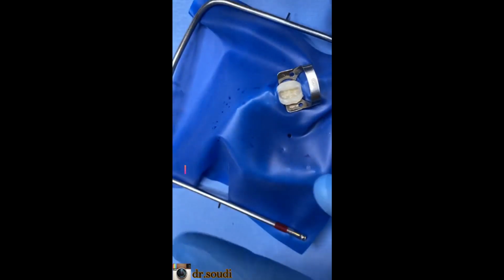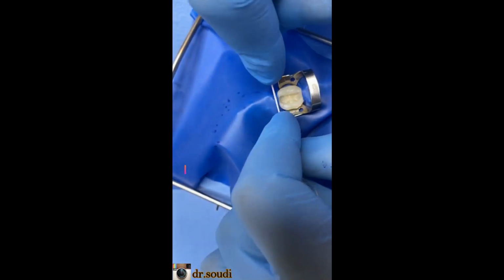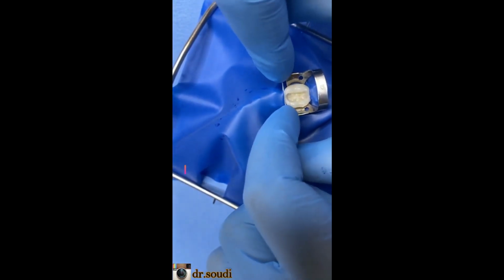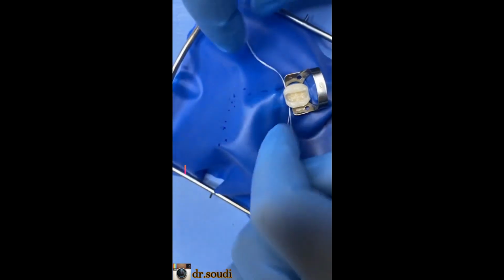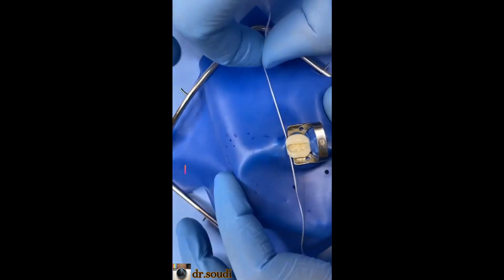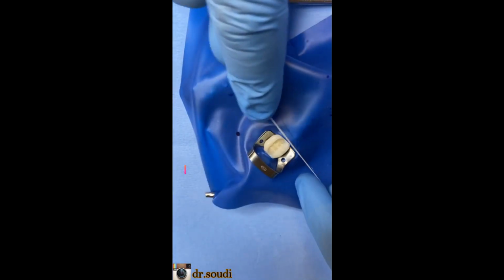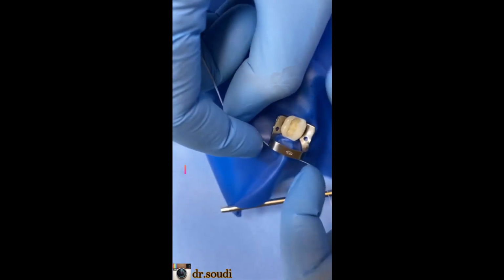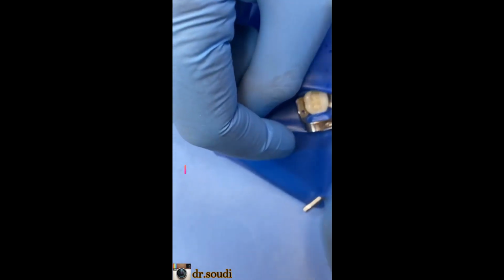Okay, is this finished? No, it's not finished. With a floss, you should pass this sheet between the two teeth like this. You press and withdraw it like this. Okay, from the anterior part, and from the posterior part. You should pass it from the posterior like this.